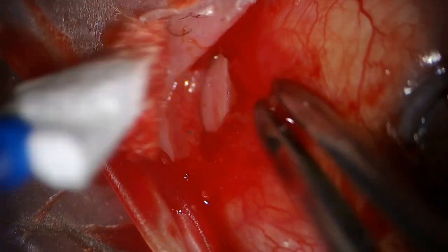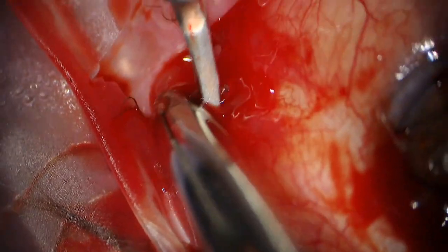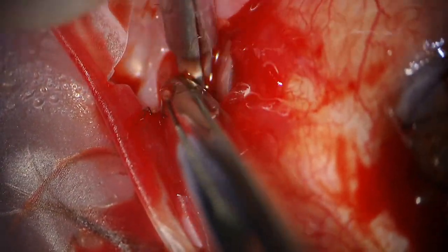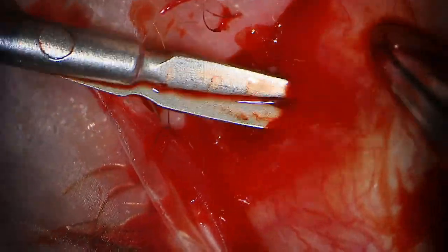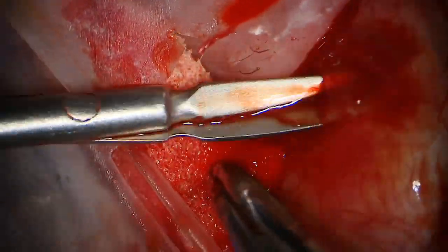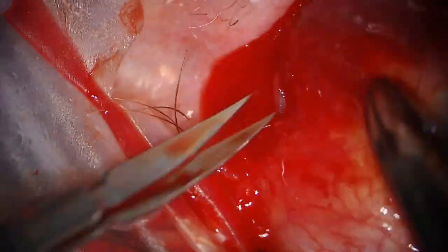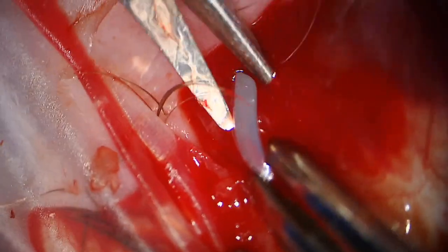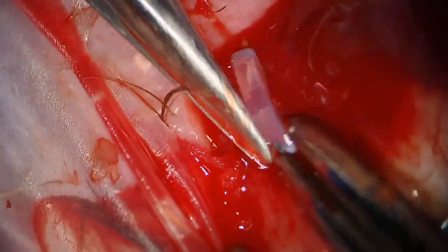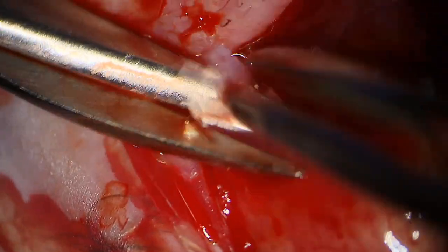But anyway, mobilize. Chopped. The plate wasn't really that far out of position. It only moved marginally. So I thought it'd be easier to cover this if I chop a bit off it. And people have described this with amputating bits of Baerveldts in the past, but I think this is the first time I've done it with a PGI. So, and then mobilize a bit more. Chop a bit more off.